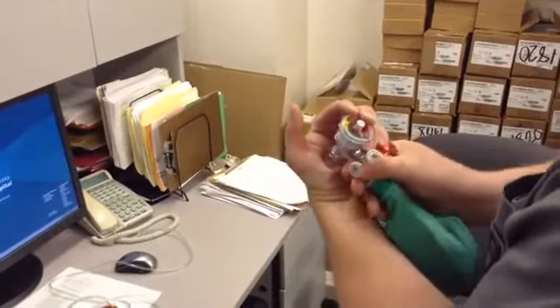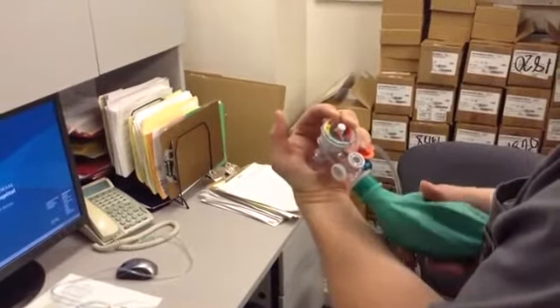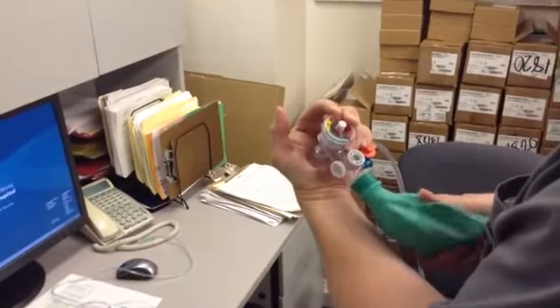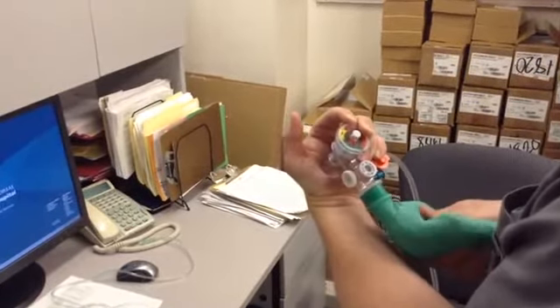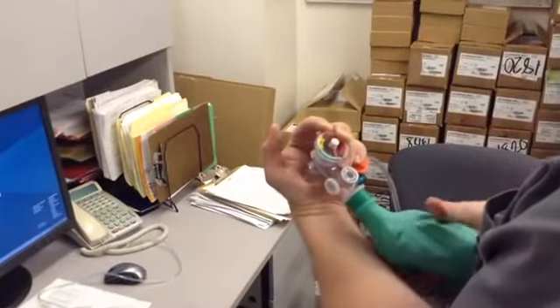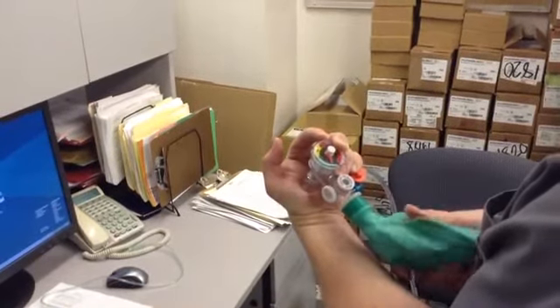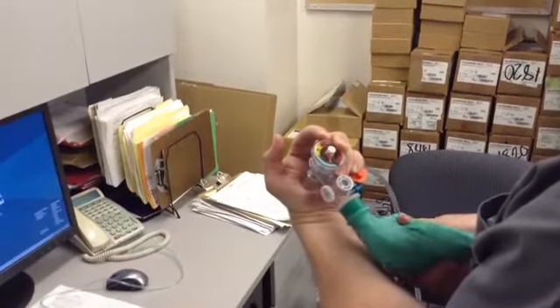And the valve is turned all the way over to me, so more air is escaping, the maximal amount that's possible. So I'm going to turn it a little bit, because on end expiration I want a PEEP of 5, and I also want to reach my pressure of 20, which I'm not doing yet. So I'm going to have to adjust a little bit more, turn it counterclockwise a little bit more, and bag at a normal rate and depth, see if I can reach the pressures that I'm looking for.